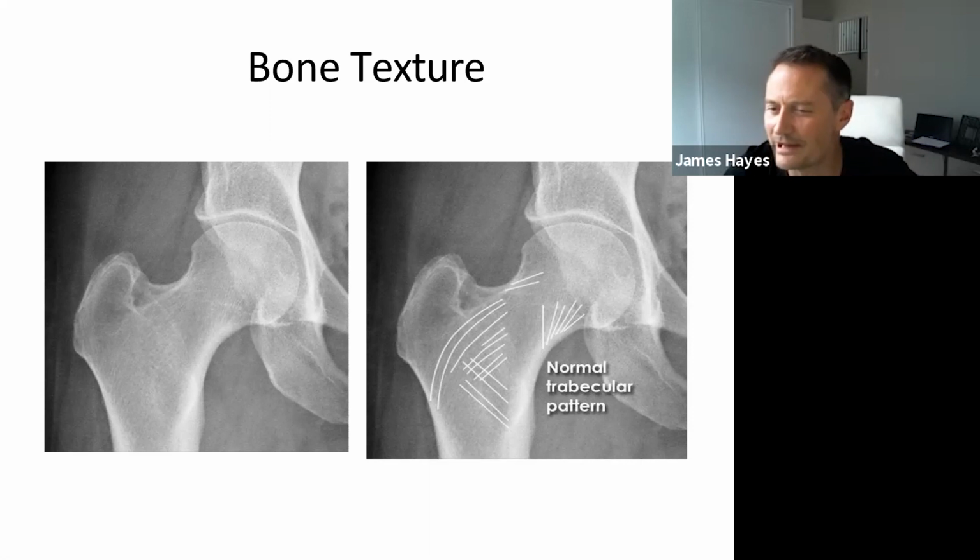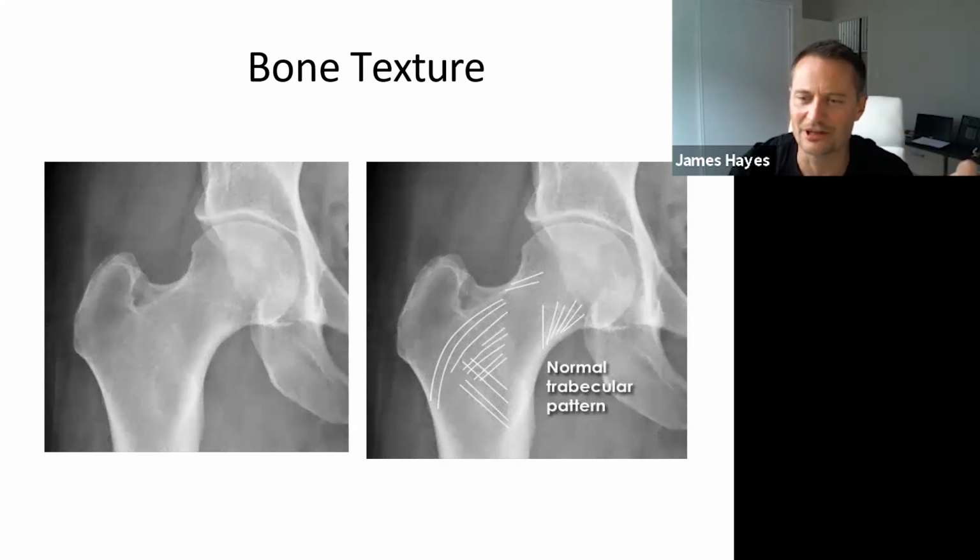And it never really made sense to me until I started off in radiography. And I was like, yeah, you can't possibly count the trabecular holes because there's hundreds of them, there's millions of them in all the bones. But you can kind of see where it's abnormal. And that, unfortunately, and I hate this expression, only comes with experience, okay? Can't be taught this, won't be taught this.